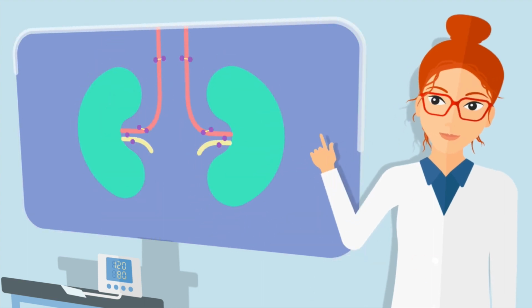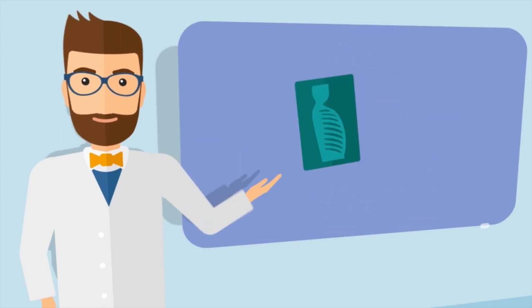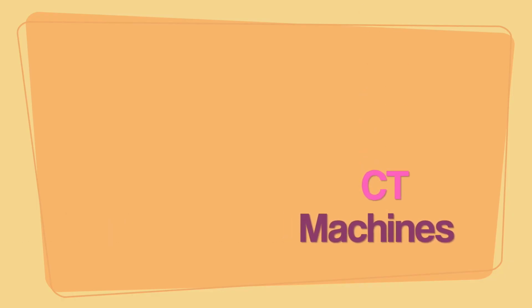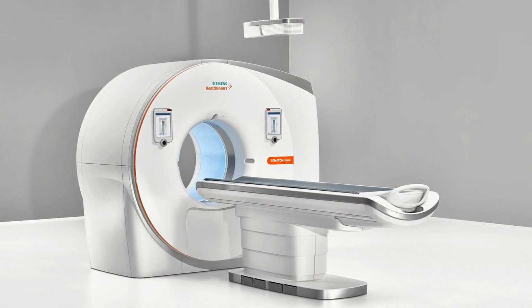After the scan, you will likely be told to drink lots of fluids to help your kidneys flush the contrast material from your body. A specialty radiologist physician, like a doctor, especially Dr. Viana, will analyze your images and send a report to your doctor usually within 24 hours.